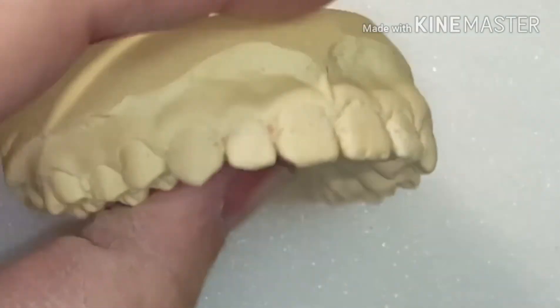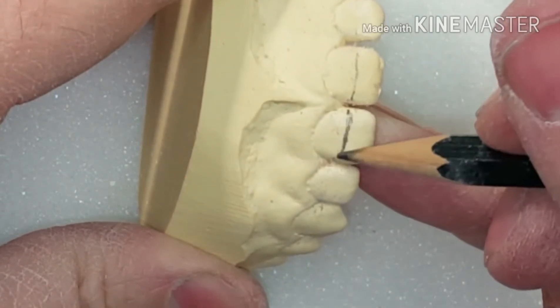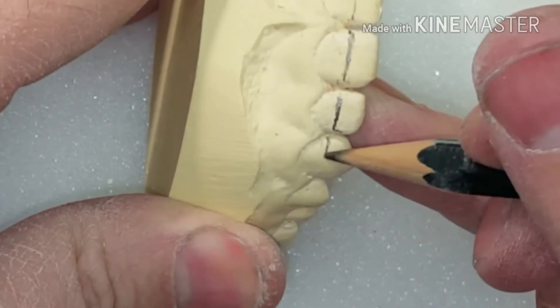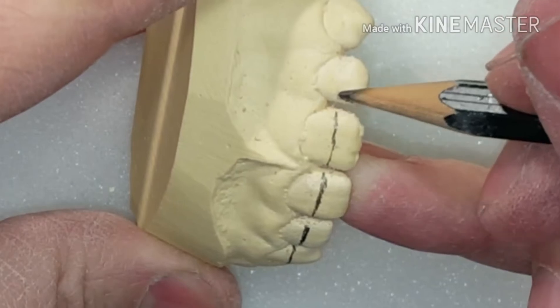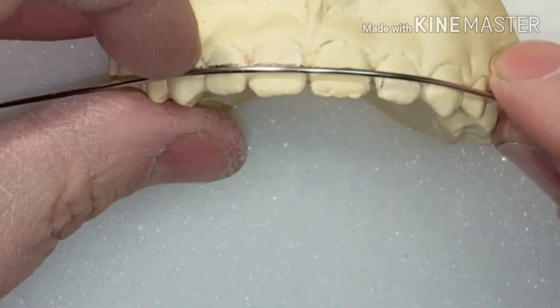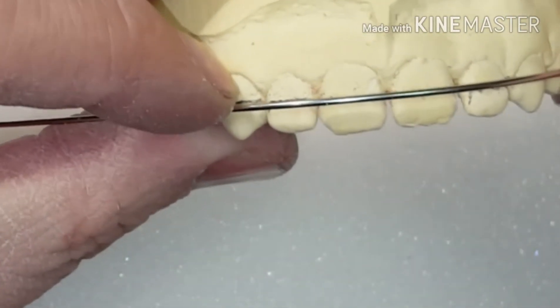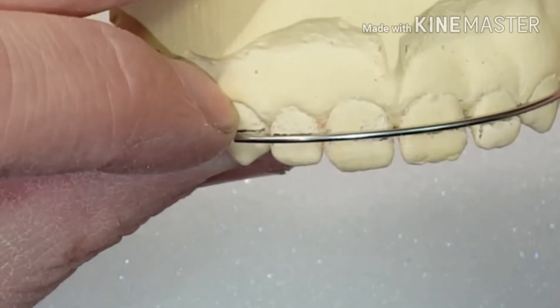So another quick tip is to mark your model. I know you've seen this probably before in other videos, but this definitely will help a beginner orthodontic bender. If you draw a nice parallel line when you're putting your wires into place, everything will be nice and parallel to the plane of occlusion.